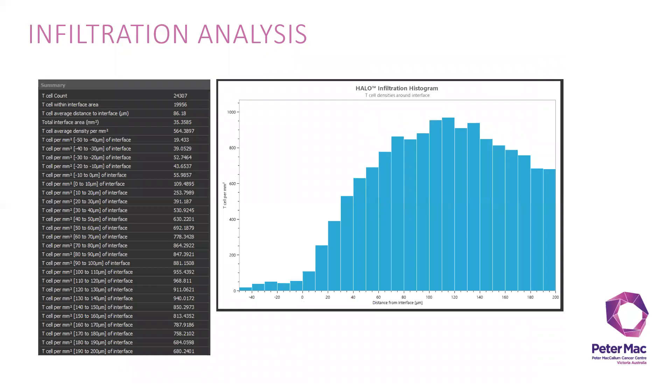From here, it will show you the infiltration histogram as well. You can see it is higher on average around 120 microns further from the tumor.